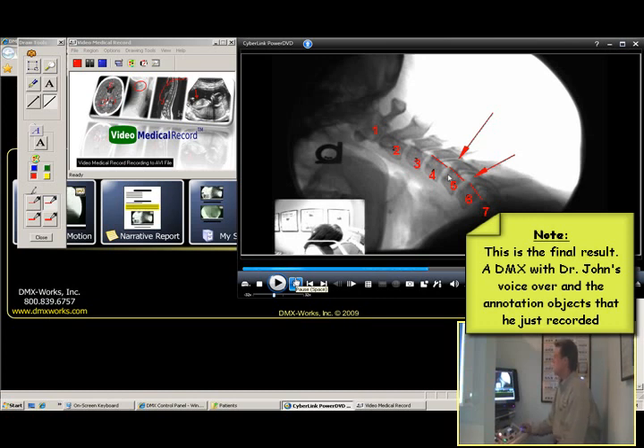I'm going to go ahead and pause that. But can you see how fast and how easy that is? From this point, this file can be emailed, it can be burned to a disc, or it can be uploaded so someone else could retrieve it from a storage site.